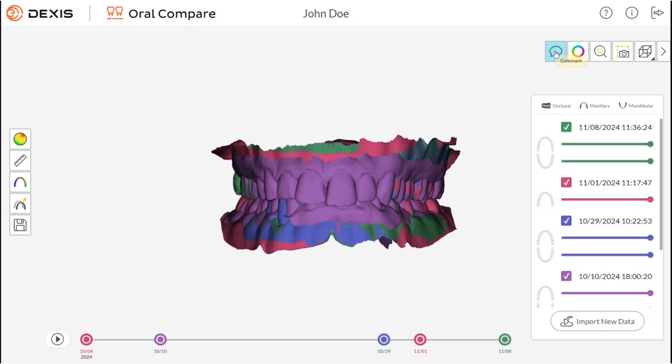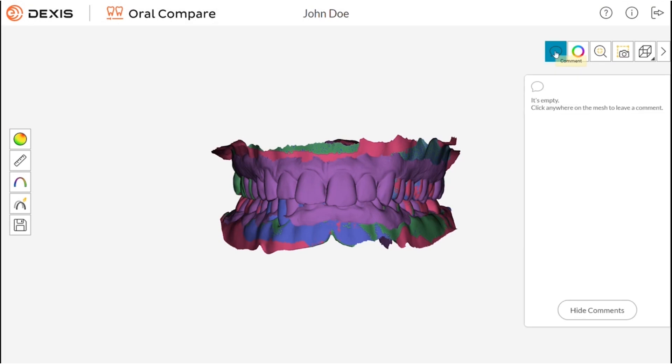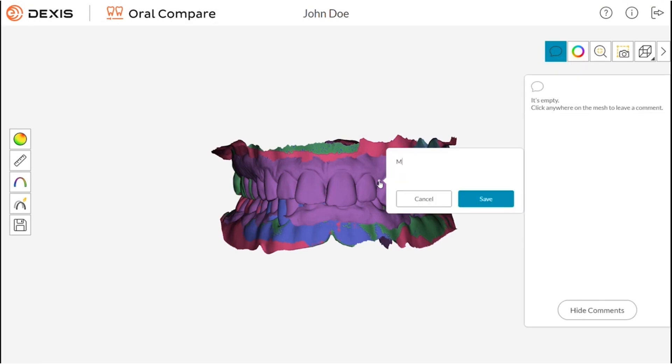Use the comment feature to easily comment and notate areas to remember for future appointments on the displayed mesh.